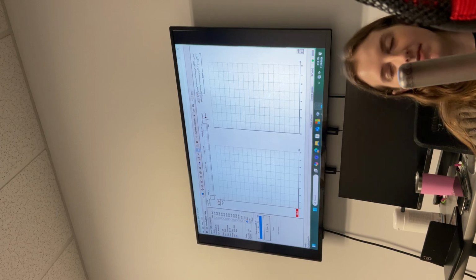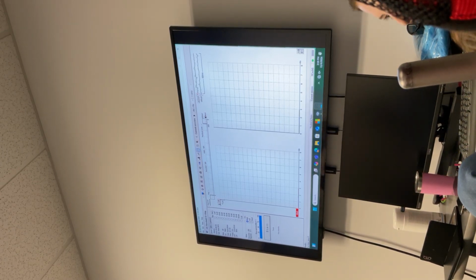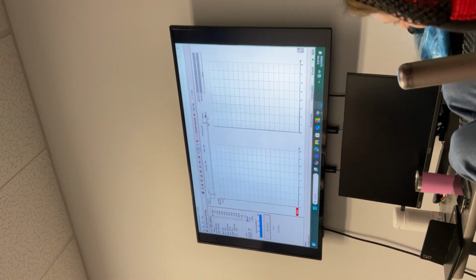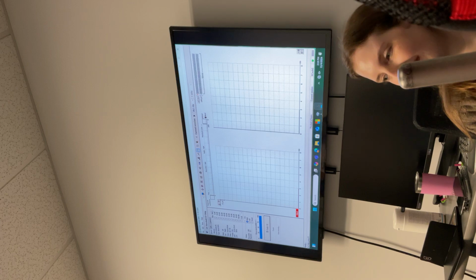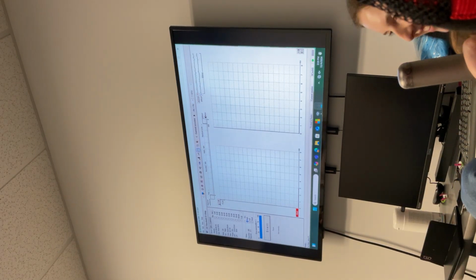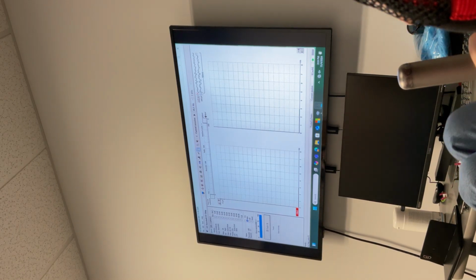Okay. So how is the impedance? Got you. Is it sticking well, this one? The ground. You can lean back, okay, that's okay. It's not sticking well. Easy is okay. You can close your eyes, we'll finish it in 15 minutes.